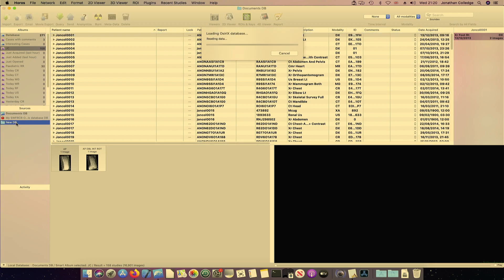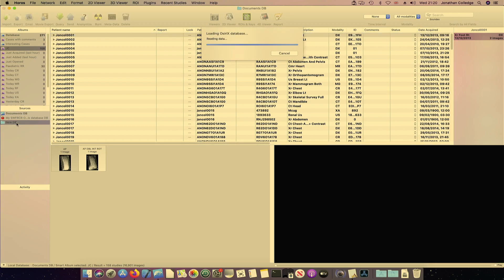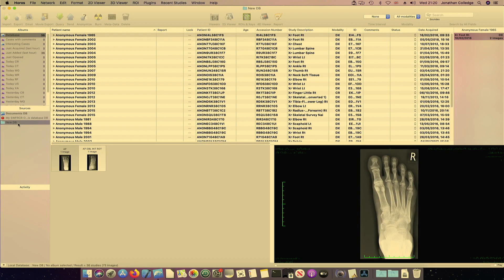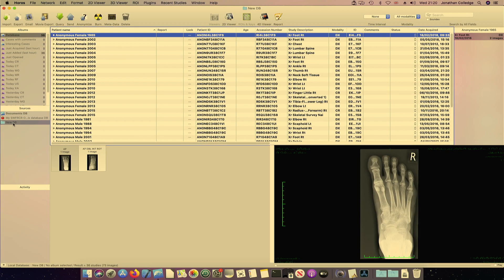So that's an introduction to databases on Horus or Osirix and a quick look at creating smart albums.